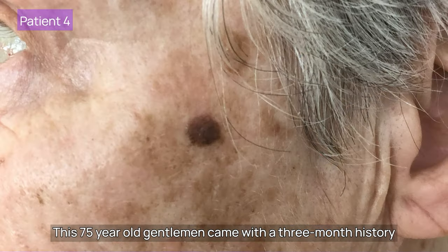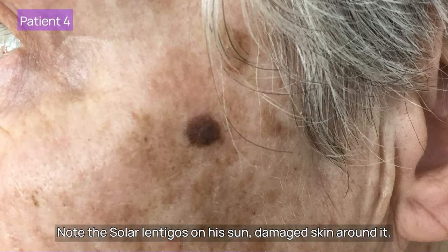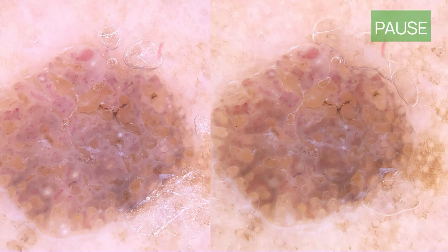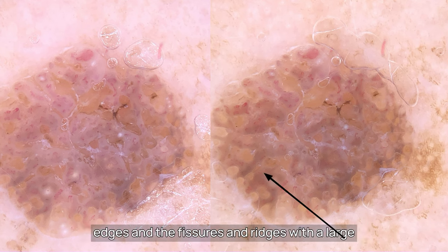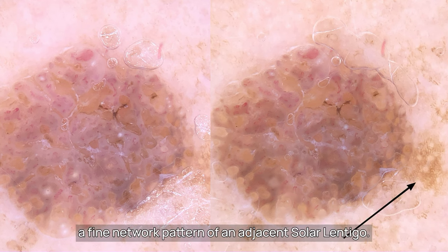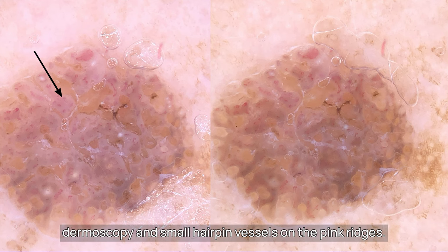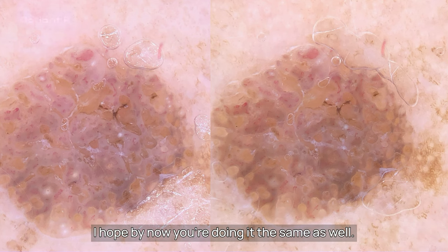This 75 year old gentleman came with a three-month history of this growing, slightly raised skin lesion on his left cheek. Note the solar lentigos on his sun-damaged skin around it. By now I hope you recognise the well-demarcated edges and the fissures and ridges with a large network-type pattern — much larger and wider than the fine network pattern of an adjacent solar lentigo. There are a few milia flashing on non-polarised dermoscopy and small hairpin vessels on the pink ridges. This just screams at me: I'm a Seb, leave me well alone.